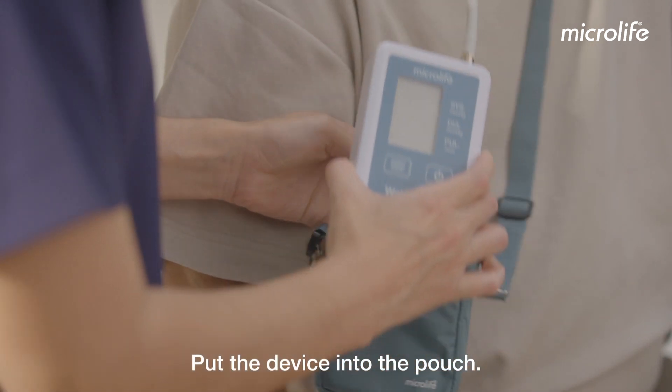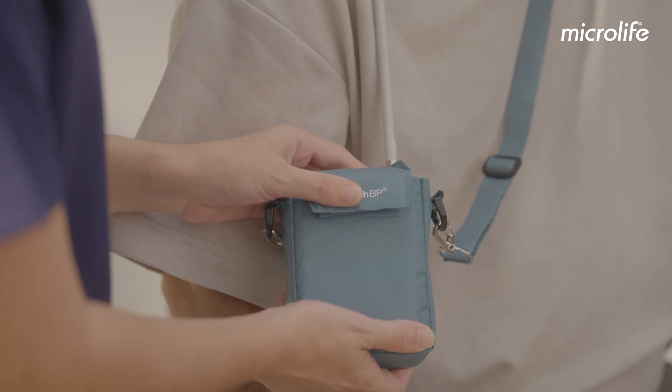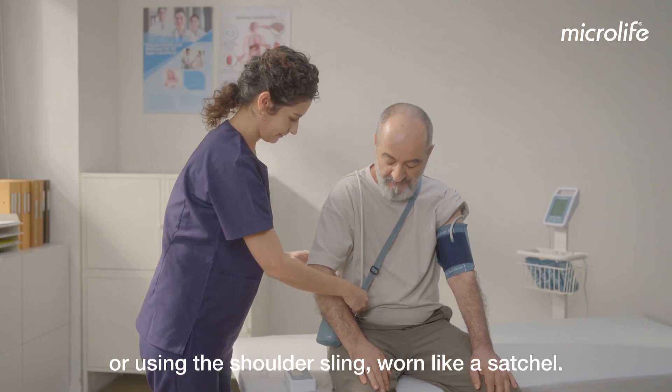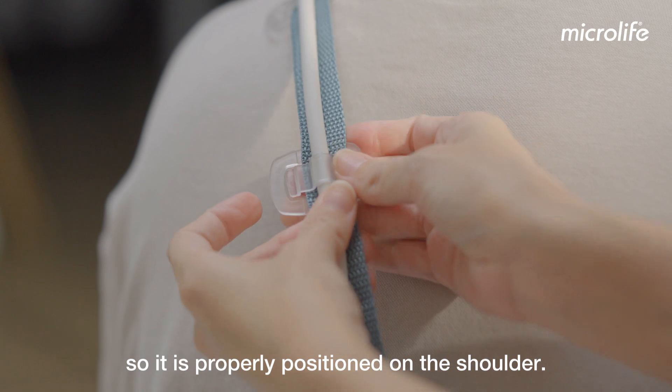Put the device into the pouch. This can then be attached to a belt or, using the shoulder sling, worn like a satchel. Adjust the tube holder on the sling of the pouch so it is properly positioned on the shoulder.